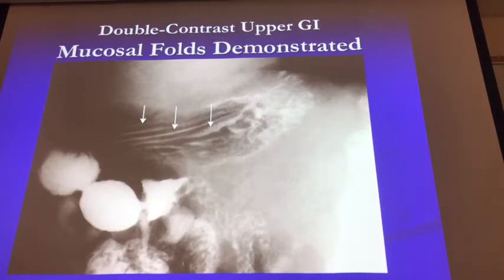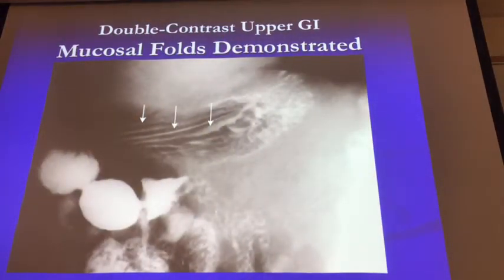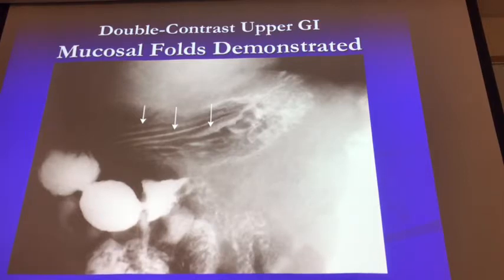You have saliva everywhere. Okay, so they take the little sparkles and then wash it with water, and then they drink. And then the barium, boom, boom, boom, boom, very quickly. Yeah, and then you tell the patient, don't burp, because their stomach is going to be filled with gas.